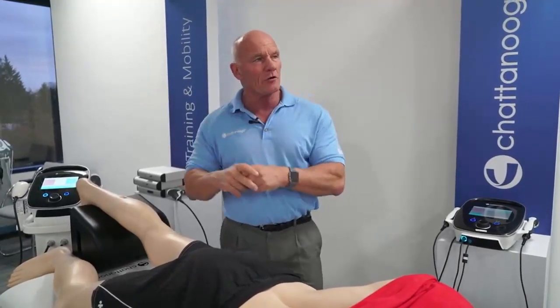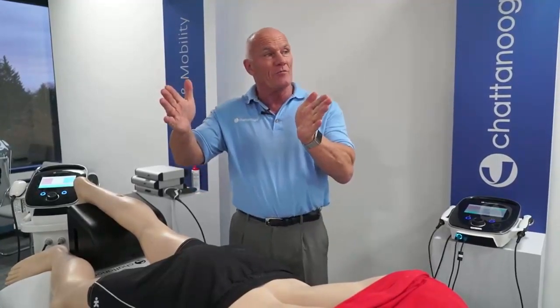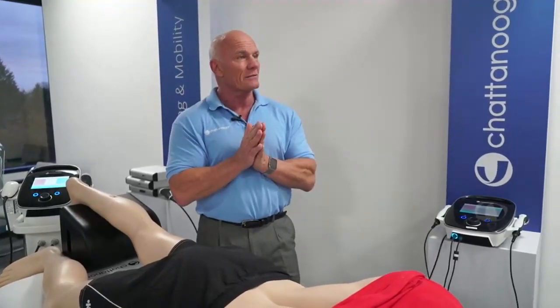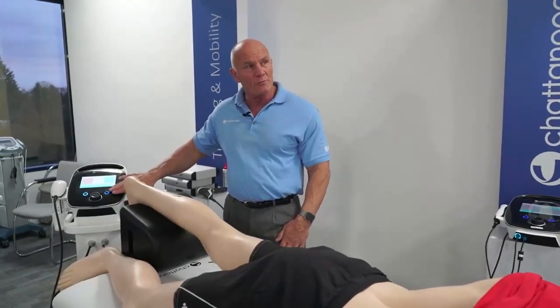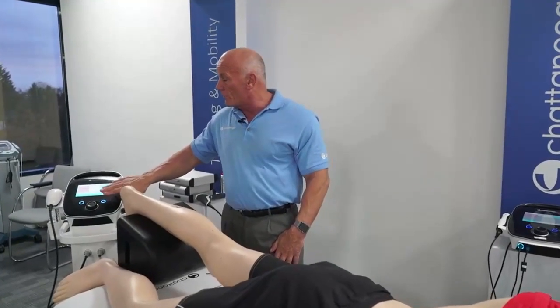Because at any point along that journey to my 4 bar, or my 5 bar if I get there, my patient's allowed to tell me to stop. That's their limit. Now, this is a unique and patented function. The comfort mode is a unique and patented function on the Chattanooga radial pressure wave machine.